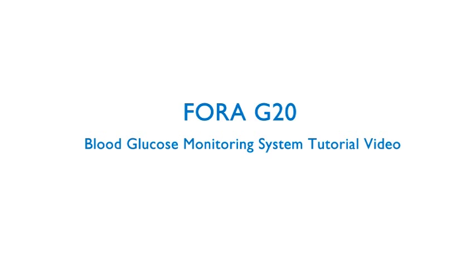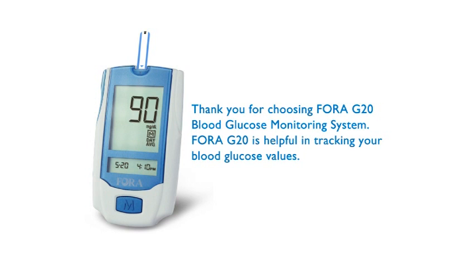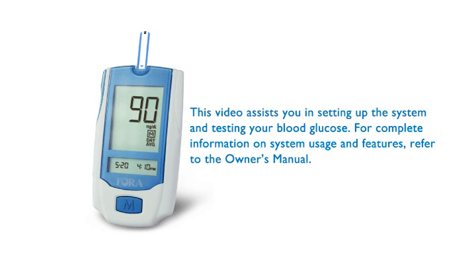FORA G20 Blood Glucose Monitoring System Tutorial Video. Thank you for choosing the FORA G20 Blood Glucose Monitoring System. FORA G20 will help you in tracking your blood glucose value. This video assists you in setting up the system and testing your blood glucose. For complete information on system usage and features, refer to the Owner's Manual.